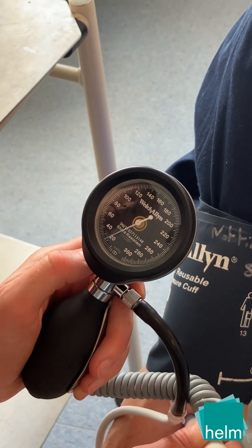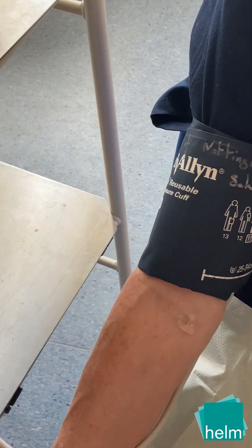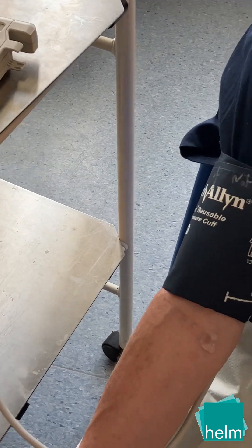At around 50 mmHg a muffled sound can be heard; this is the diastolic reading, as the artery is almost fully open.